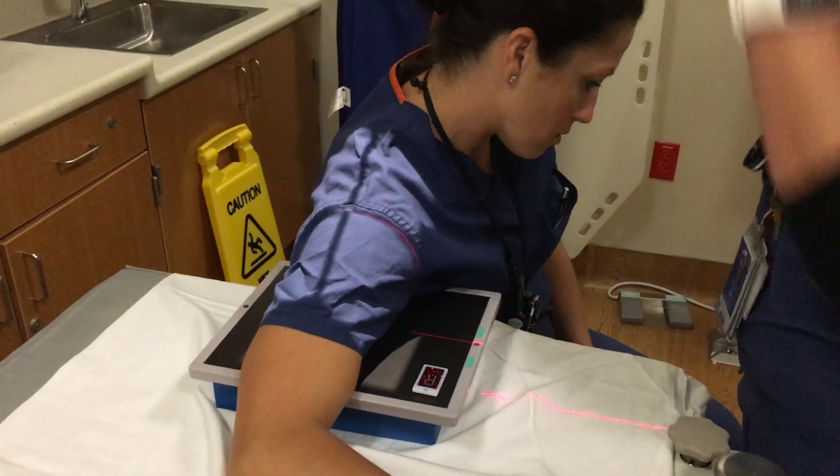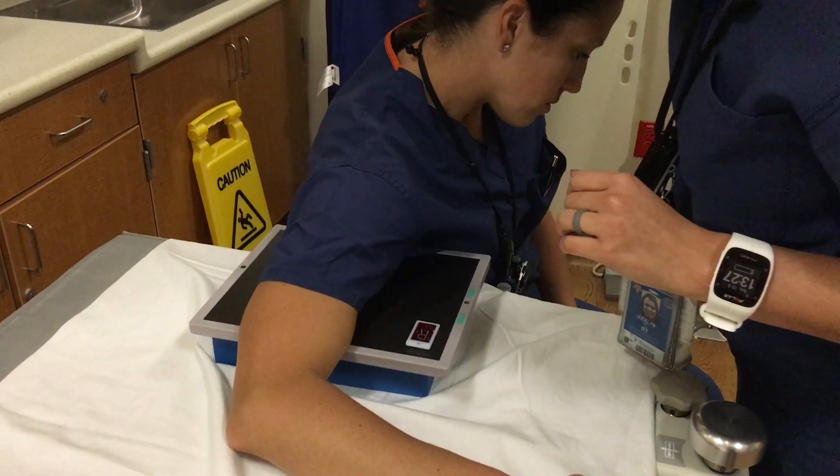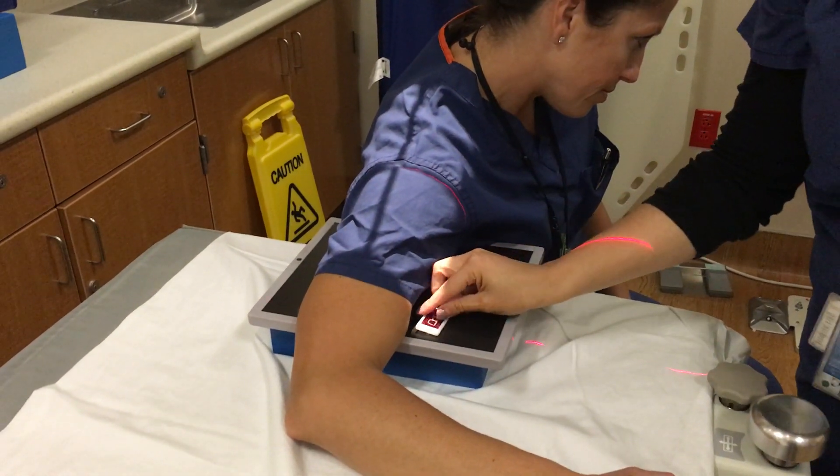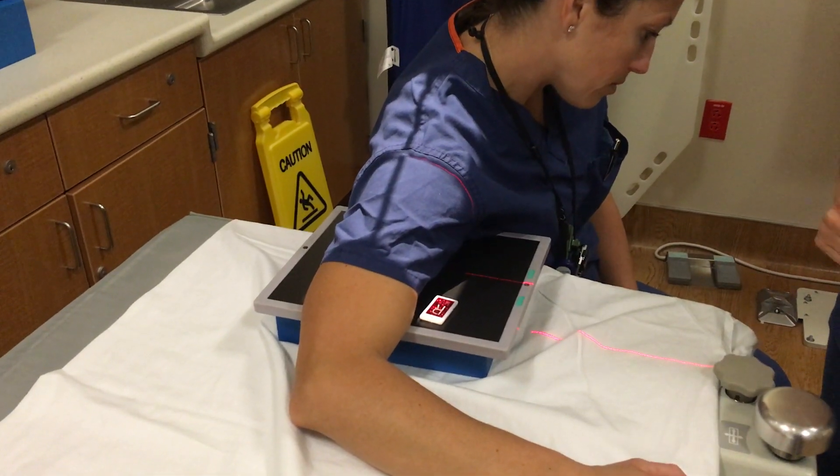Then you're going to collimate in, place your marker in the light field, and then you're just going to have them hold their breath.